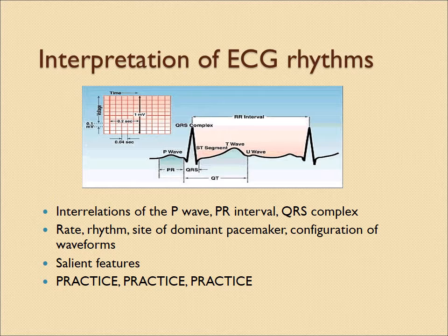And then, when we look at certain heart dysrhythmias, there are certain salient features that are critical for that particular rhythm to be diagnosed as that rhythm. So I will identify those as we go through these dysrhythmias, and then the final thing I have to say is you just have to practice, practice, practice. This is not something that just automatically comes to you. It's something that with time you get better and better at.